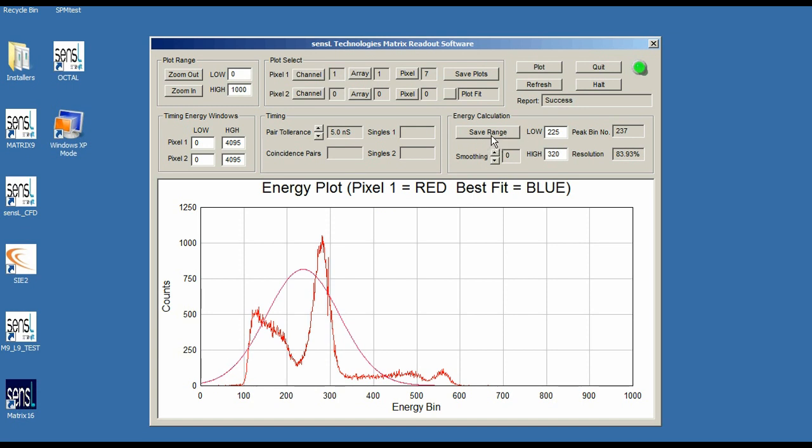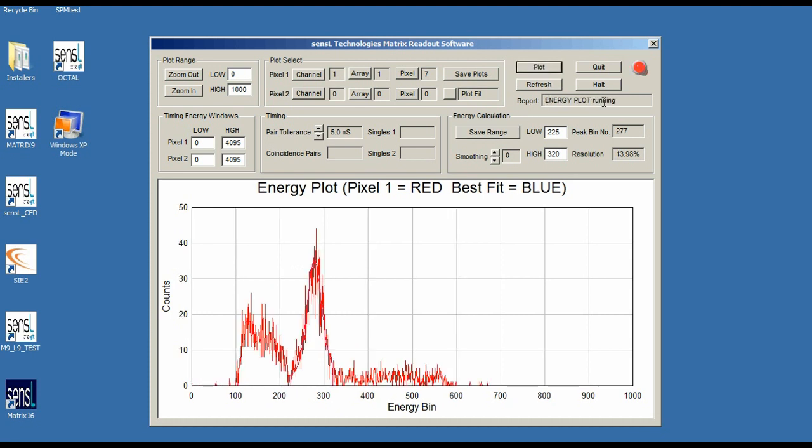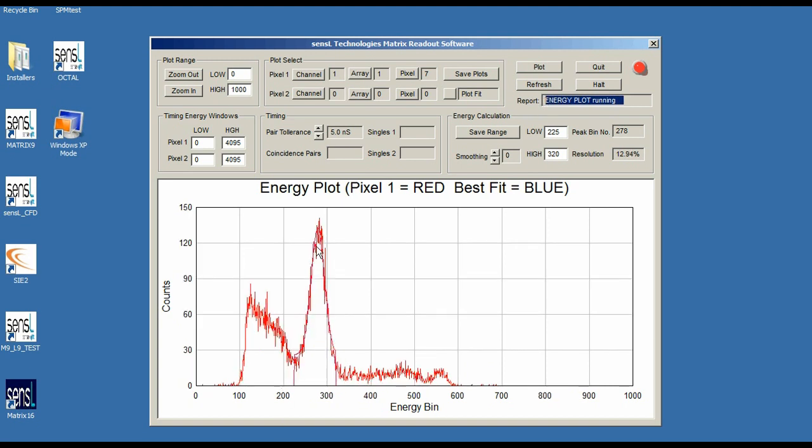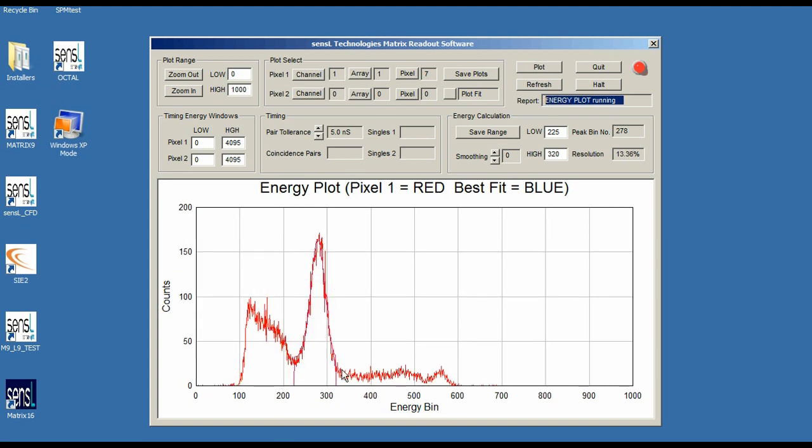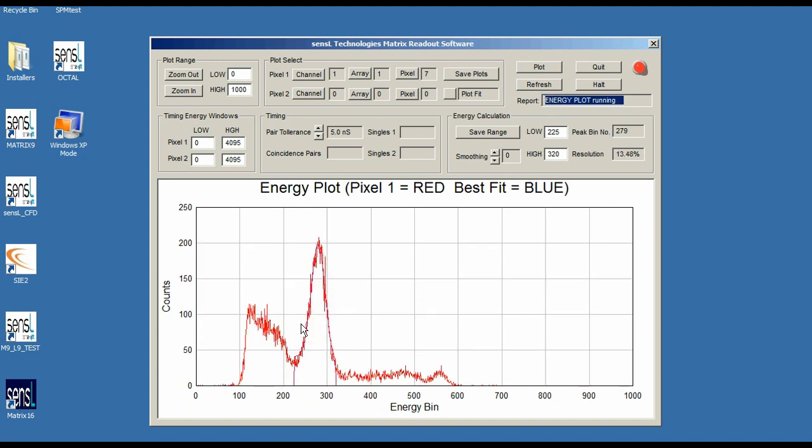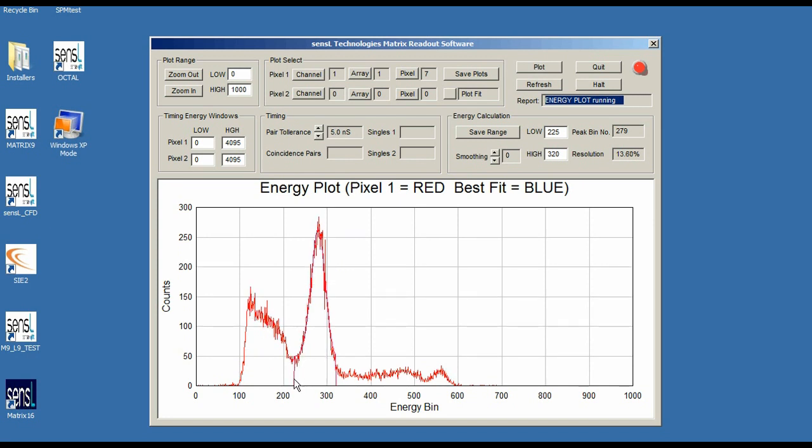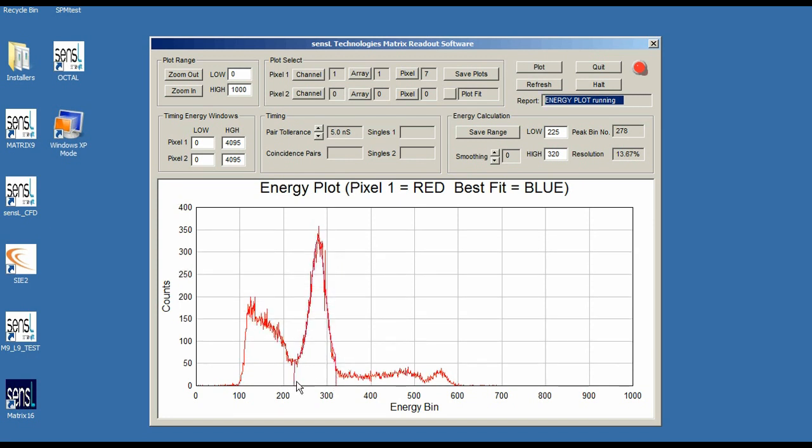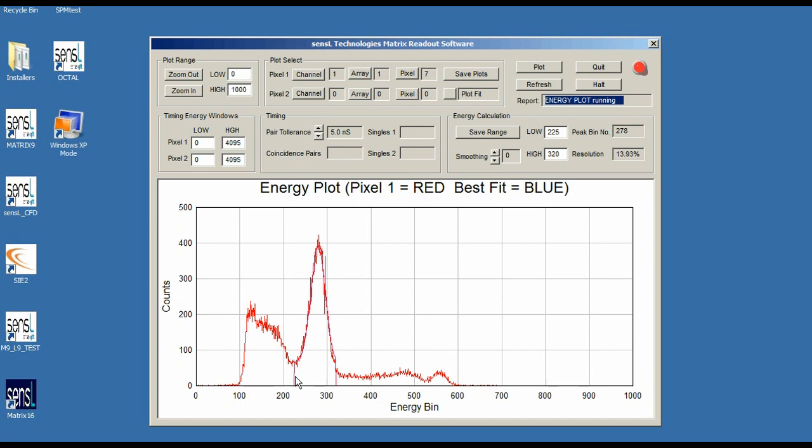Now to make this work, I need to click on the save range button and I need to replot the whole graph. So now the energy plot is running. You can see our energy plot starting to come out of the noise and you can see the curve fitting.